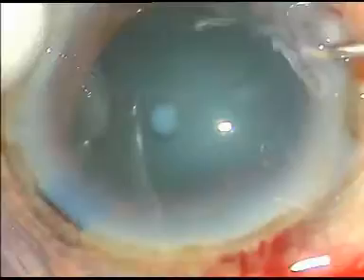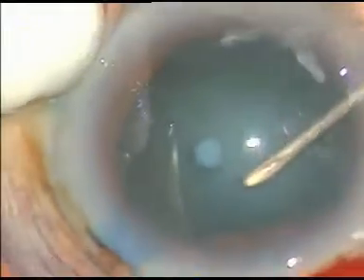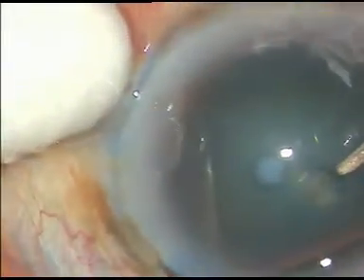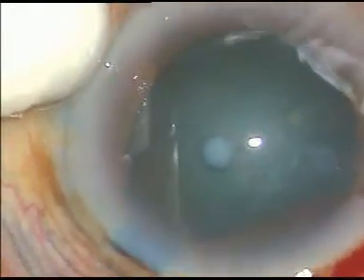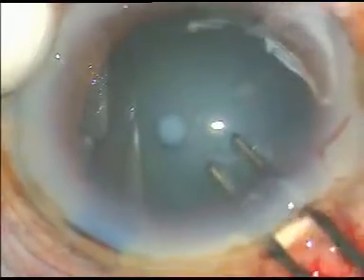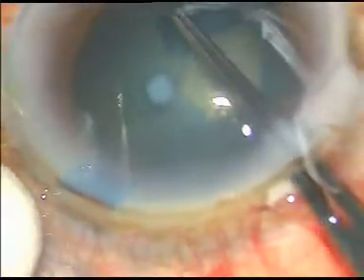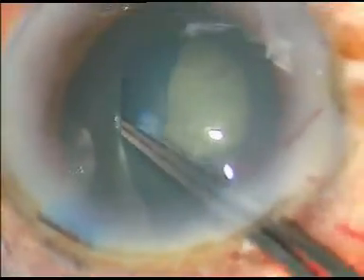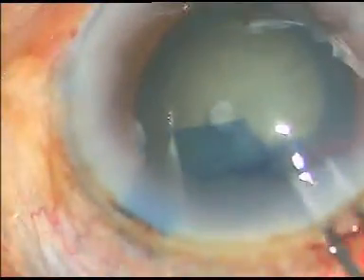A 26-gauge bent cystotome is used to incise the capsule and raise a flap. Then utrata forceps are taken to hold the flap and make a continuous curvilinear capsulorrhexis in this way.